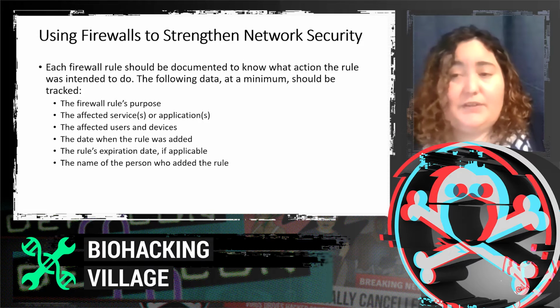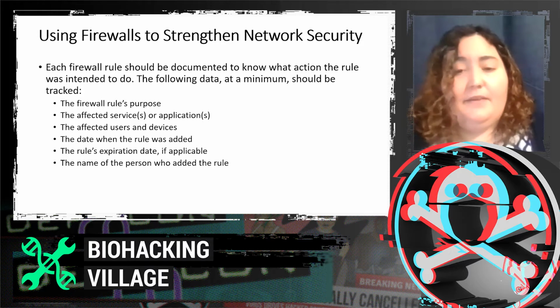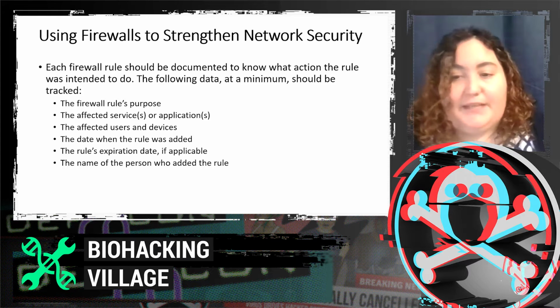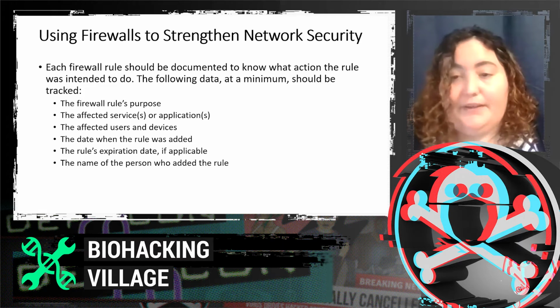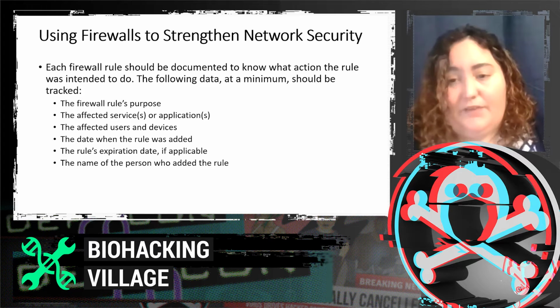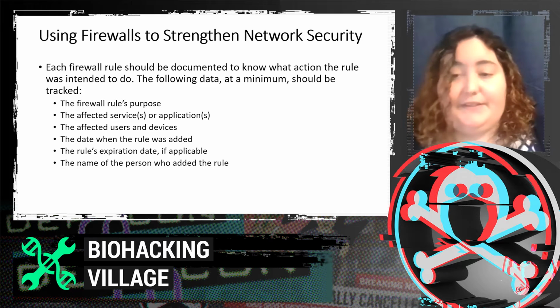Firewalls are your first line of defense for securing healthcare networks against the public. Firewalls are digital walls that stand between protected health data and potentially dangerous threat actors. You want to start by blocking all traffic by default, and then only allowing specific traffic to identified services.